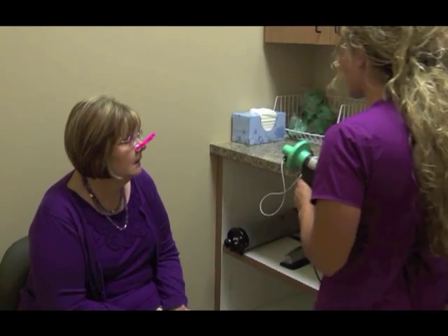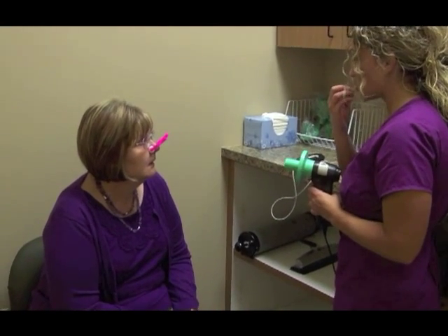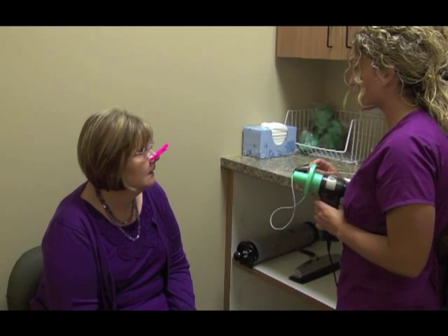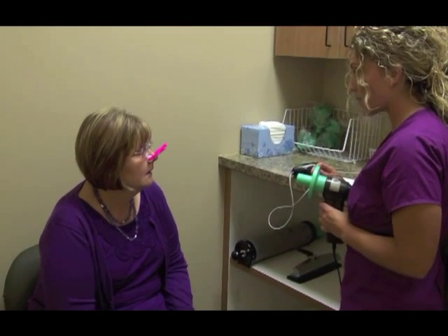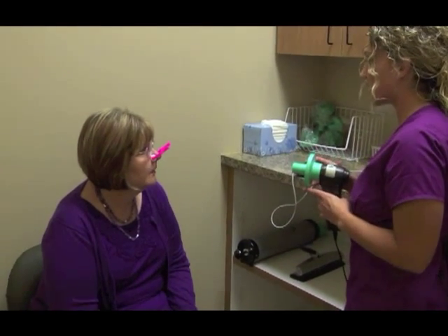So with this test, what you're going to do: you're going to place this green piece in your mouth, just past your teeth, making a nice, tight seal. You're going to start with two regular breaths — full, complete breaths. After that second breath, I'm going to have you take a big, big, huge breath in. Hold it until I tell you to blast out.